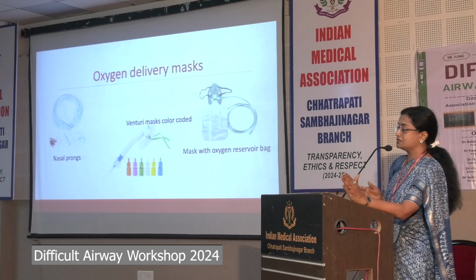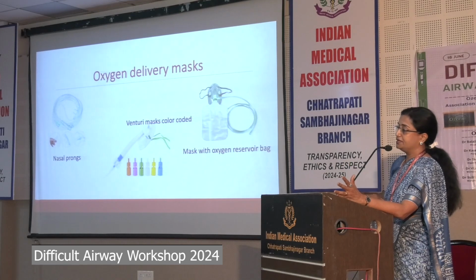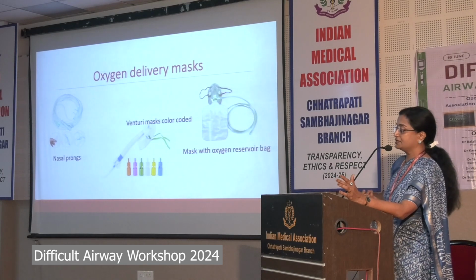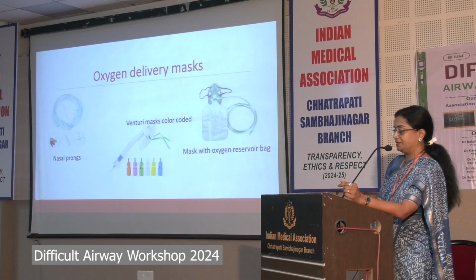The nasal prongs go in right from when the patient enters the OT. First you put on the oxygen, and meanwhile, while the patient is getting pre-oxygenated, the monitors and the rest are attached. Even the drug preparation can be done after the nasal prongs are in place. Venturi color-coded masks are available, and also masks with oxygen reservoir bag. These are mainly for the post-operative period.